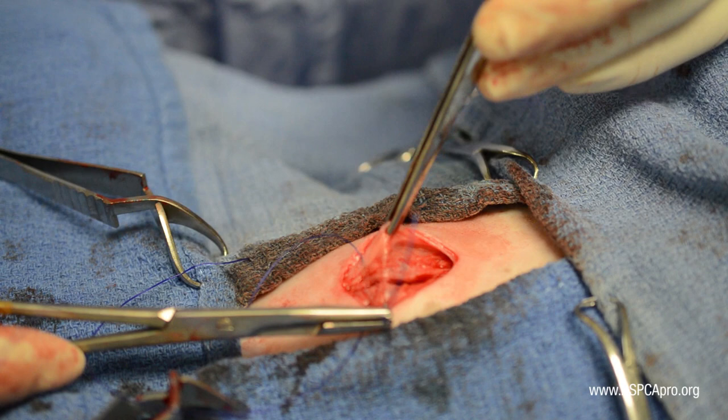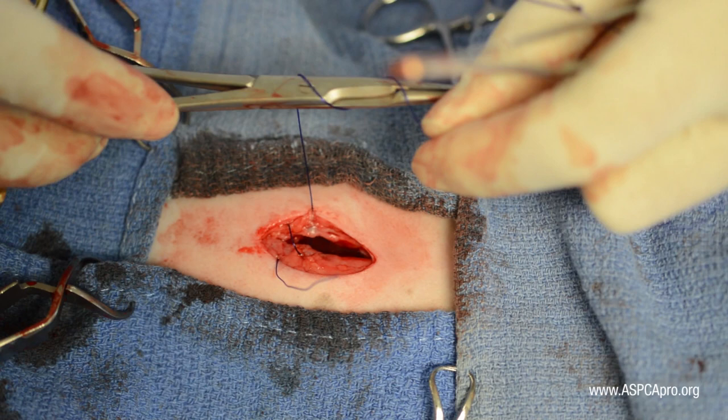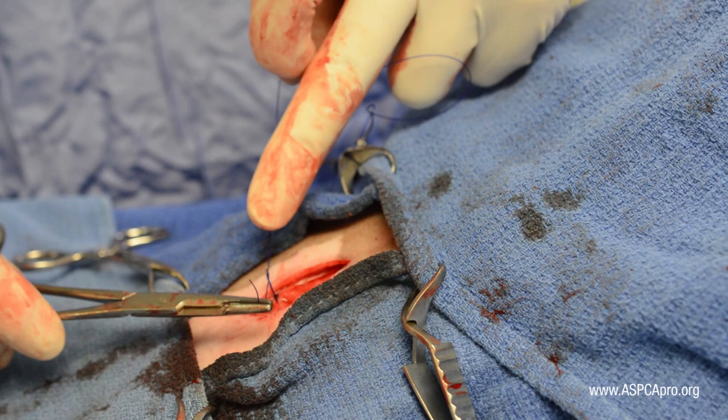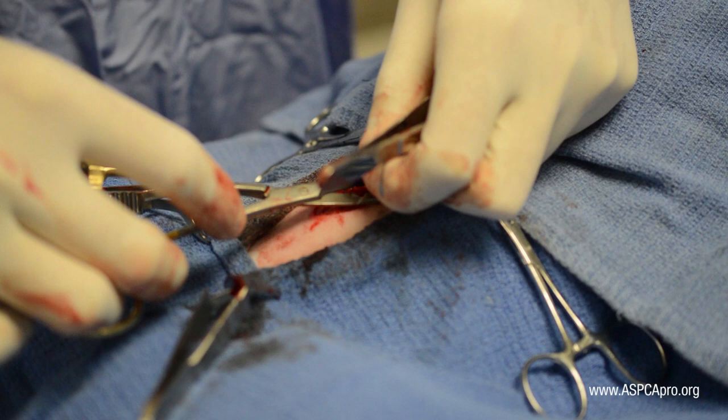A surgeon's throw may be used for the first tie to allow for apposition without crushing the tissue. Three more throws are then tied to complete the cruciate pattern. Suture tags should be cut short to avoid potential irritation to the subcutaneous tissue above.